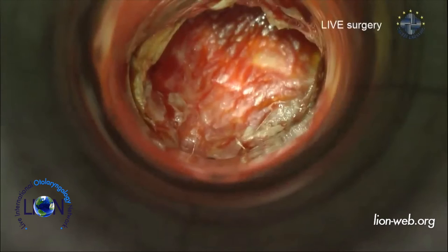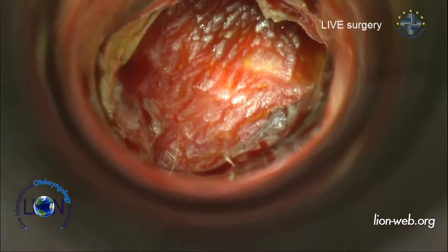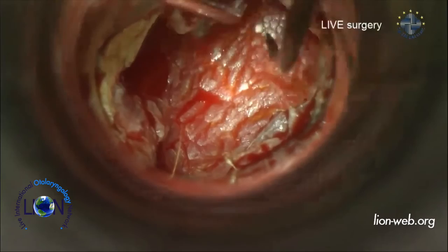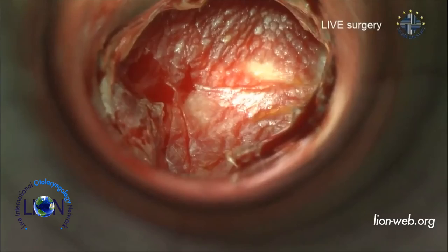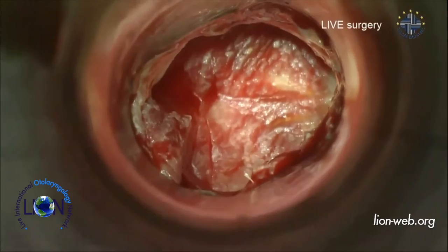So it's difficult for you to see the position of the prosthesis, but I can show you that I've already made the preparation of the approach and took a cartilage from the tragus already. So you can see here the tympanic membrane, of course, and the head of a prosthesis here. What you can see a little bit of a white here. This is the head of a prosthesis, which seems to be fine here, but it's not the same all the time. So this is why we finally decided to revise. And the best option for her would be to use the malleus replacement prosthesis to stabilize completely the prosthesis, because, of course, in this case, there's no more malleus.